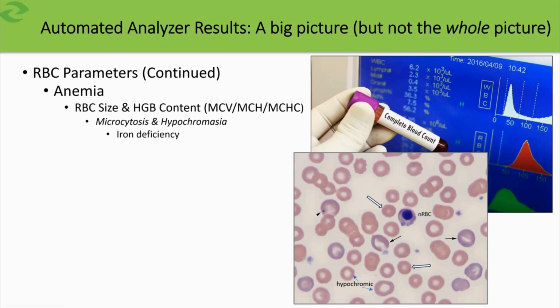So iron deficiency, classic for that. However, more recent research has shown that with iron deficiency, with that anemia, it used to be classically called non-regenerative anemia. However, depending on what the underlying cause is of that iron deficiency, you may see a cyclic regenerative response. So it just depends on where you catch them in that response. So as the bone marrow obtains a sufficient store of iron for heme synthesis, then you may see a mild regenerative response there. But again, the classic is a non-regenerative anemia with that.